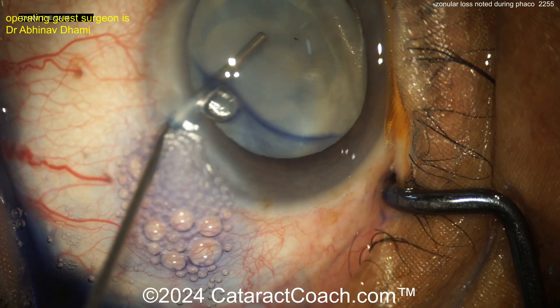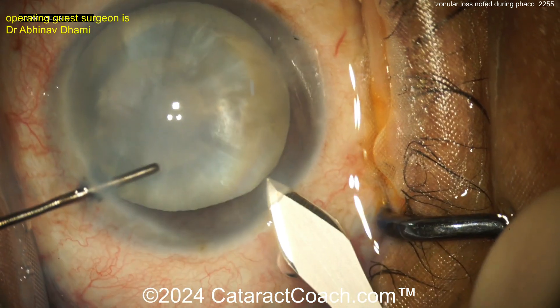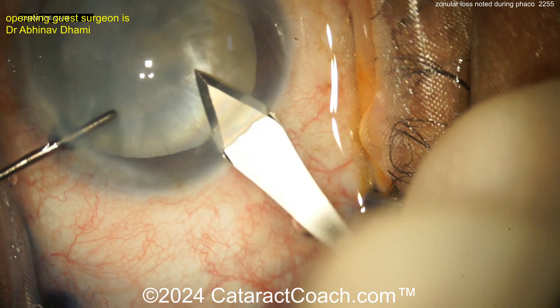Let's use less trypan blue dye. Now viscoelastic fill and let's see the main incision. All looks pretty good.